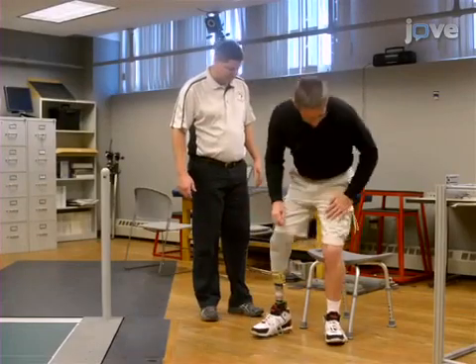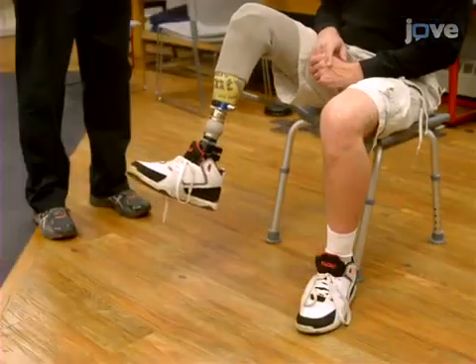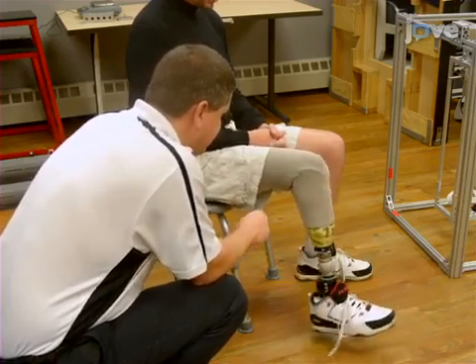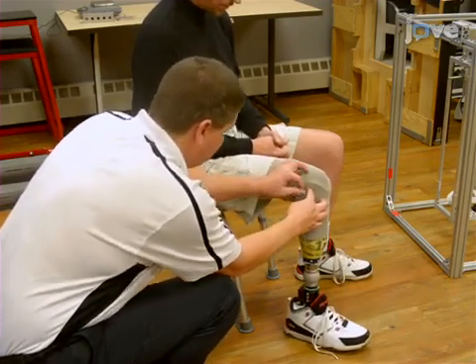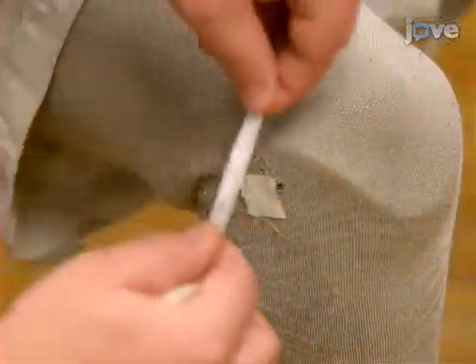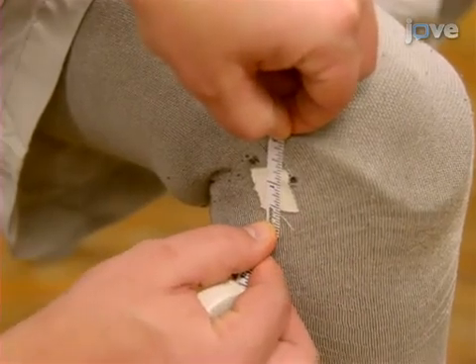To begin, sit the amputee in a chair where the prosthetic leg can be comfortably lifted off the seat so that the subject can perform a series of knee flexion and extension actions. Next, identify the knee center of rotation, or COR, and place a small piece of tape at the COR. Then, measure the distance from the lip of the prosthesis to the knee COR.